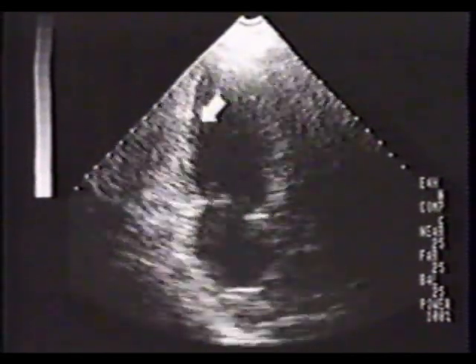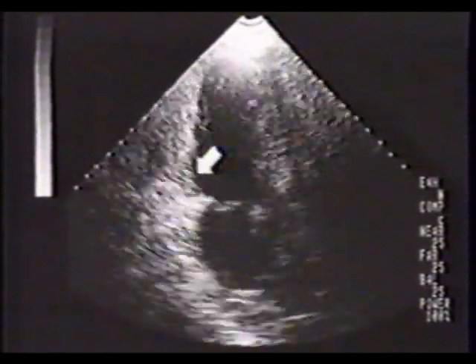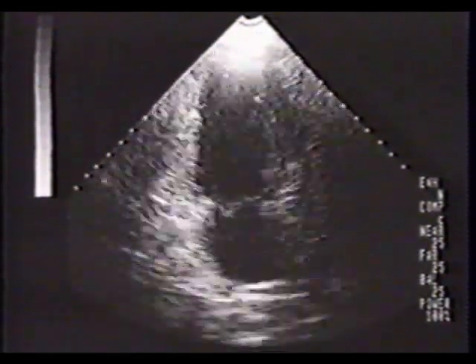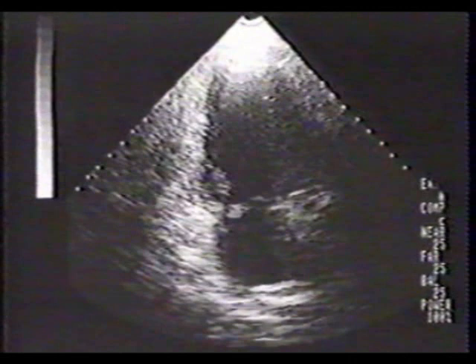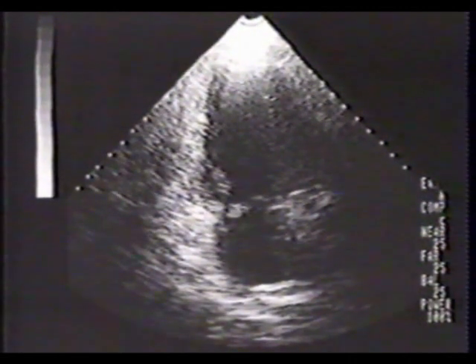In real time, the inferior infarct is also evident. Following the echo, an intra-aortic balloon pump was inserted, and this patient underwent successful mitral valve replacement.